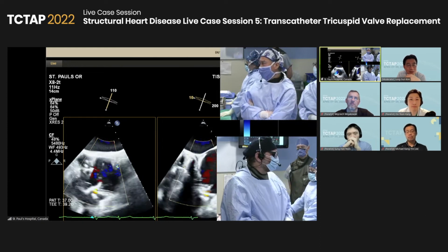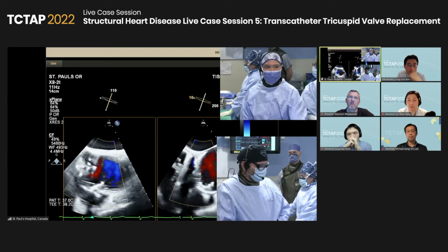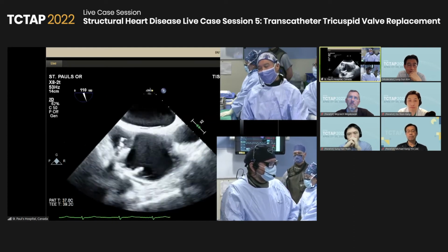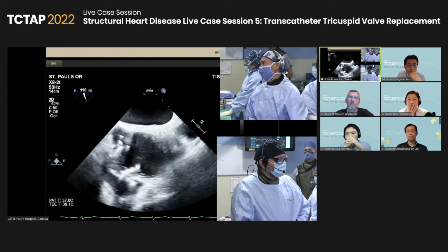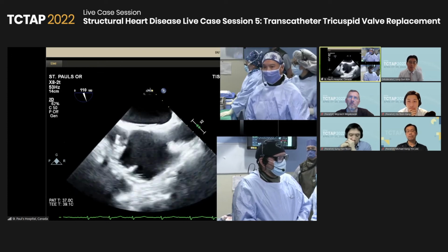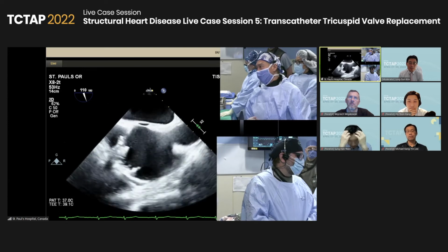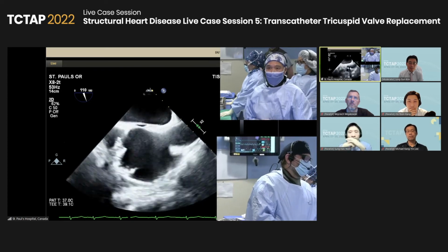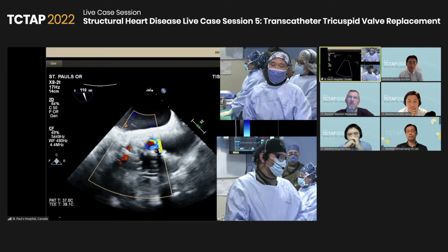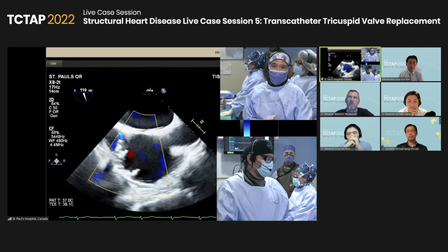Yeah, so this is a right ventricular side, right? As you say, a mild perivalvular leak is really not sufficient to warrant any treatment. So we just leave them. We just observe them, see how the clinical status is. Because having a small leak compared to, let's say, a left-sided device, where the pressure is much higher, you might end up with a small leak with no hemodynamic significance, but you might have hemolysis.